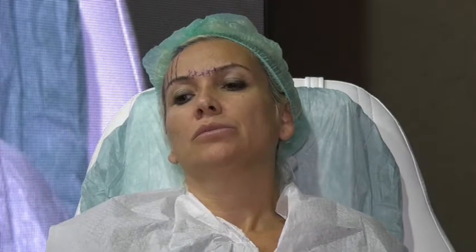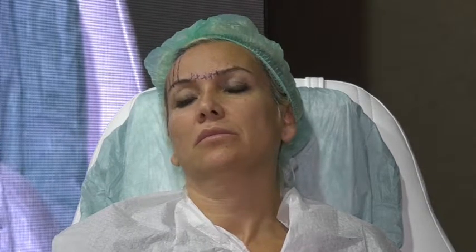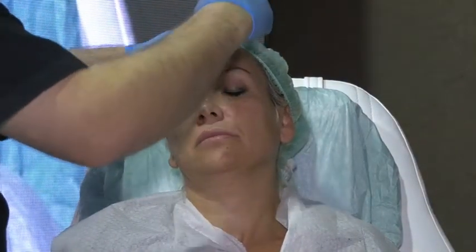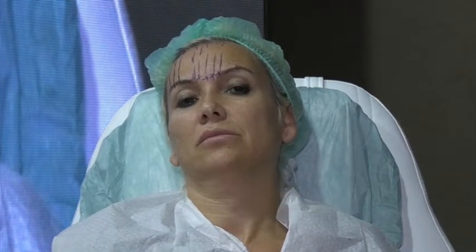So, you have no limit if you work in a proper way. If you understand what you are doing, you have no limit. You can do what you want. You can make your patient happy. You have a lot of solutions. Because this area has no solution. If it's falling down, over-flipped, there's no solution. The only solution is to put threads like that. It's no problem at all. That's not an issue. That's a really very nice and good result.